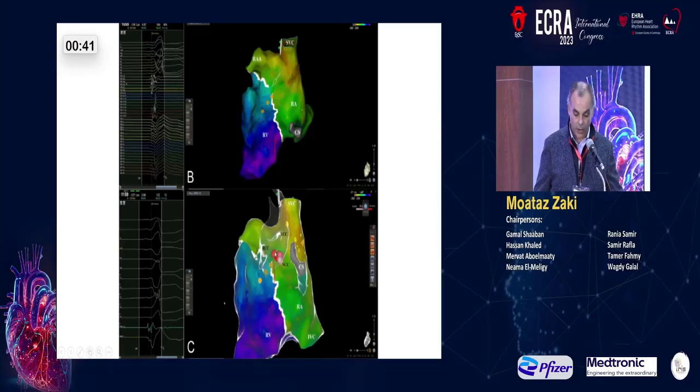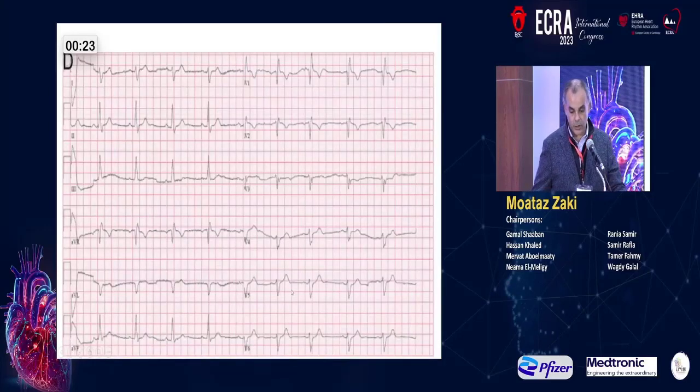left coronary cusp, yes, the non-coronary cusp, right? Okay. Yeah, and then deliver ablation lesions here, guided also by the electroanatomical map, with restoration of normal conduction, but with a right bundle branch block, which can occur because of the multiple failed ablations before. So they ablated the right bundle in the previous sessions, but fortunately enough, no severe conduction defect.